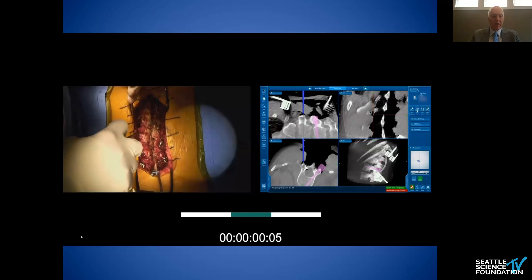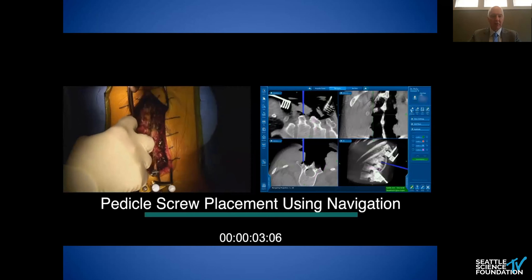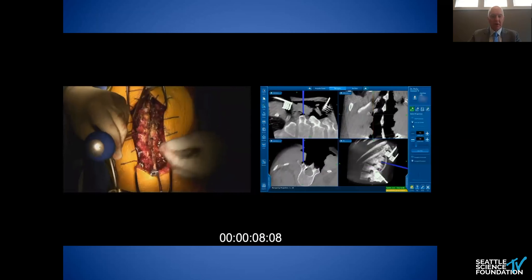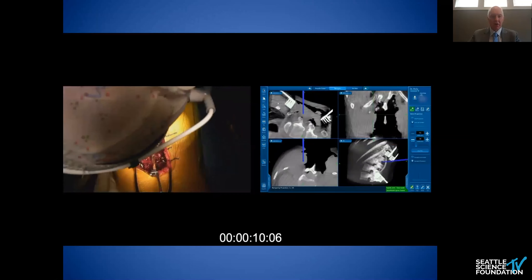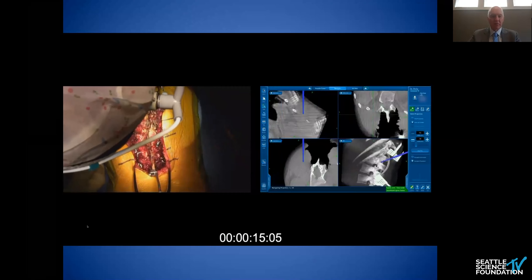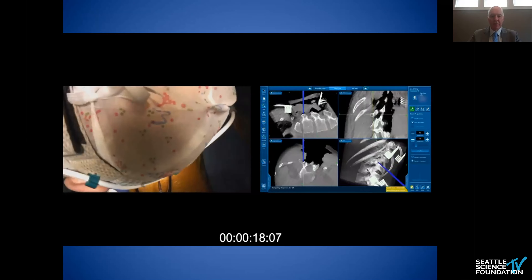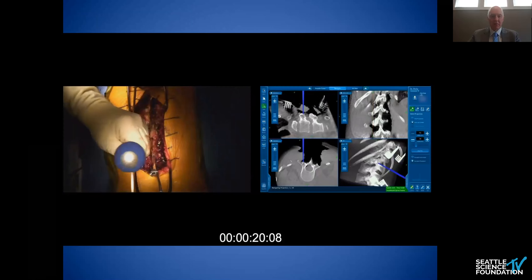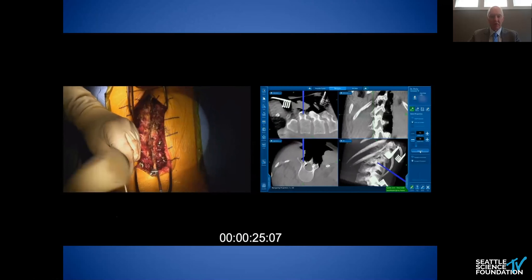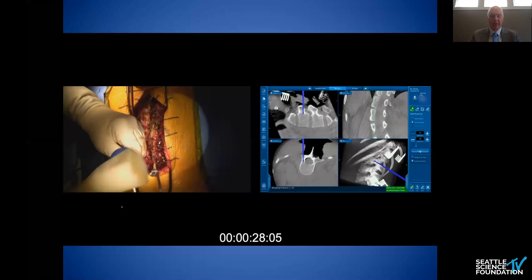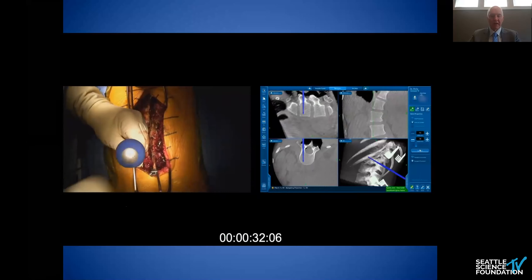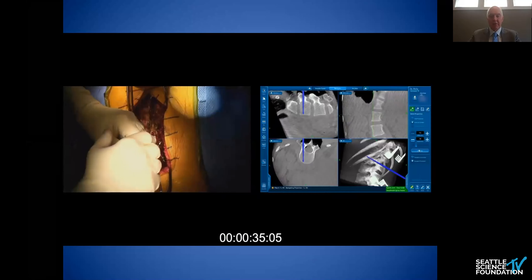You say it takes a long time — here is an unedited video of our workflow. We've exposed the spine, put the reference frame on at the caudal aspect. I use a navigated awl to find my start point, a burr to create a cortical defect, then place the awl and mallet it in. In very small pedicles, we'll use a drill instead, or if the patient is myelopathic. As we do this, I'm judging the screw length based on the navigation screen.